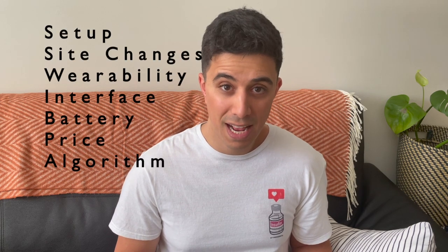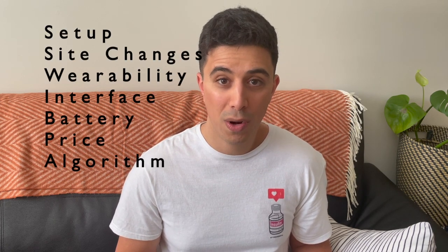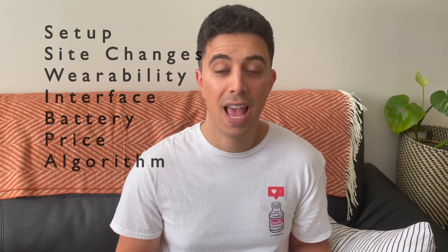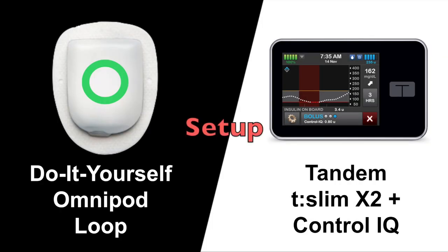Today I'll be looking at a few categories, namely setup, site changes, wearability, user interface, battery, price, and algorithm.